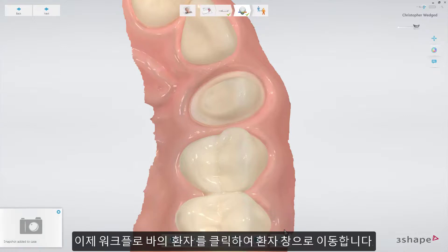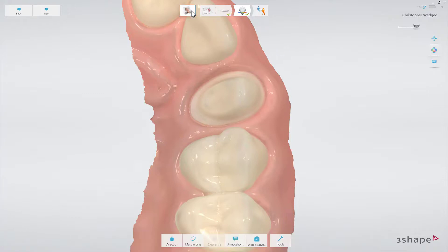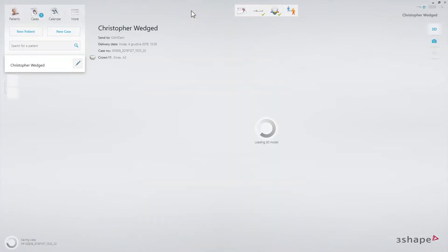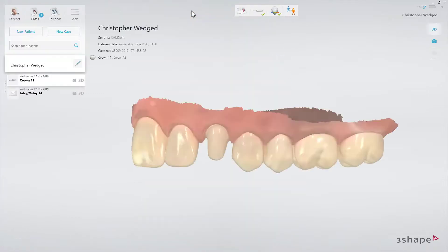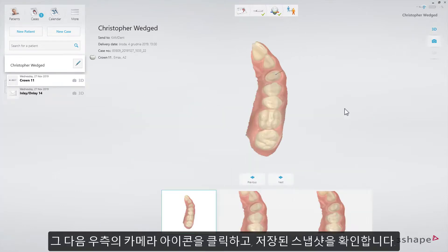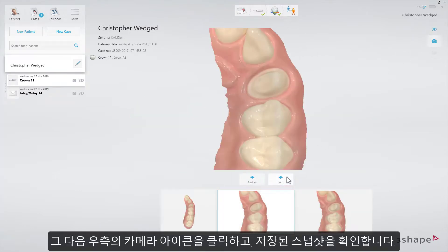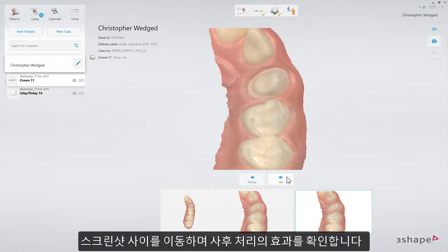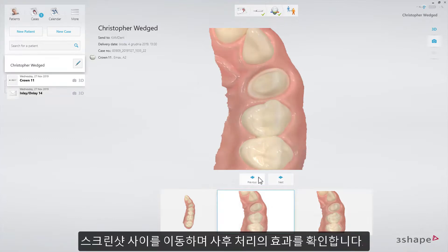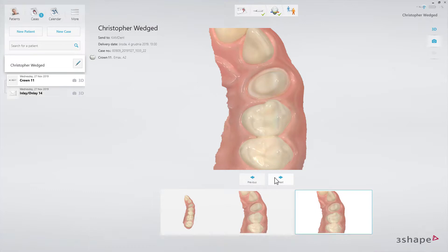Now go to the patient window. To do that, click on the patients button in the workflow bar. Then click on the camera icon on the right side and select the snapshots from the list. Switch between the screenshots to see the effect of the post-processing.